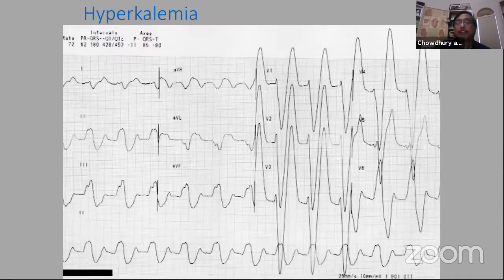To familiarize yourself, and we call it here the sine wave, meaning that if the EKG looks like a pulse oximetry wave, then there is big trouble. So everybody should have it in your brainstem reflex that once you see this EKG, you don't ask for potassium level. You start treating, please. Start treating. Hafiz, yeah. Can I make a comment?